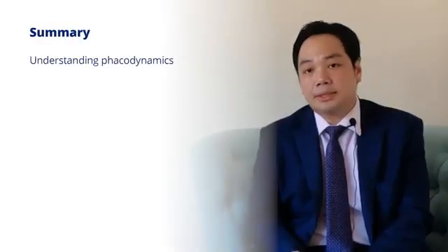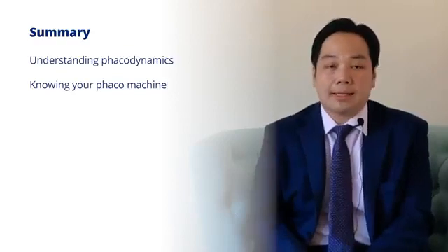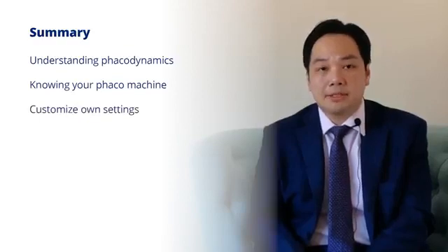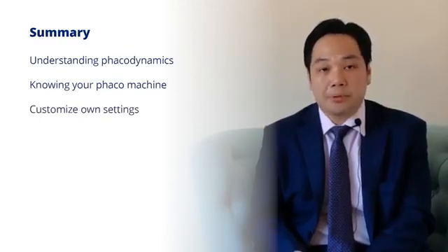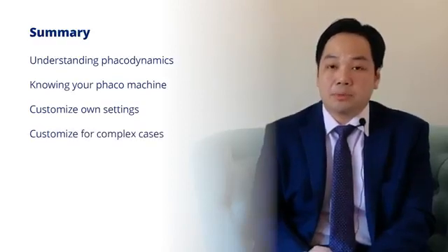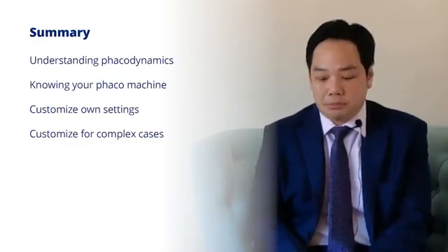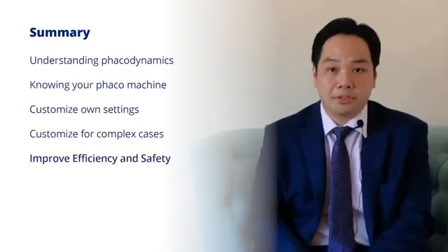So just to summarize what I've been going through so far, it is really to understand the phaco-dynamics, and it's important to know the interplay between the infusion pressure, the vacuum that you put, and the flow rate and how much ultrasound energy for the different cases. And really understanding this and then knowing how your phaco machine can deliver these parameters are important for us to then customize our own settings. And more importantly, when we approach complex cases, the standard ones are standard, and when we start dealing with complex cases, is when these customized settings can really help improve our efficiency and our safety.